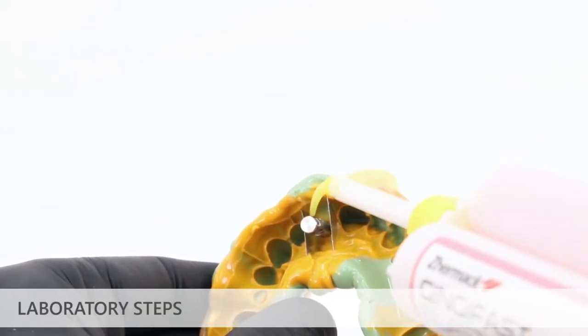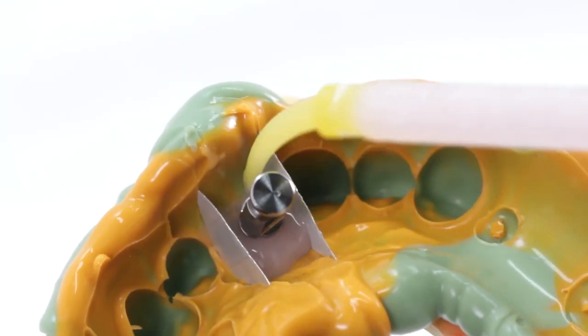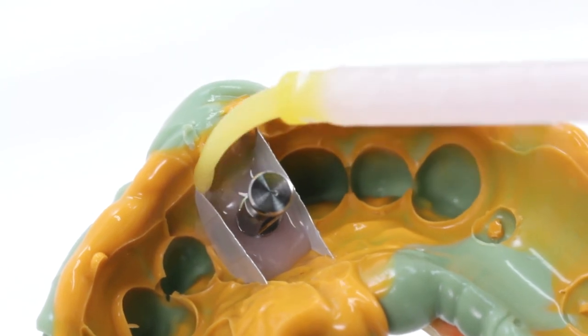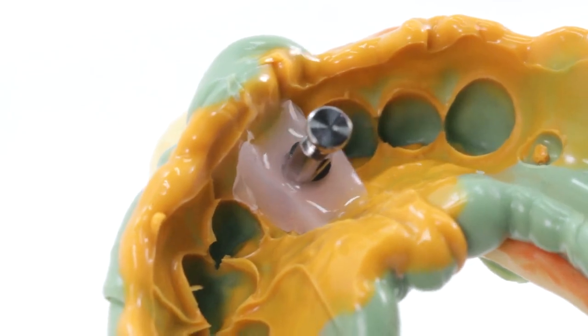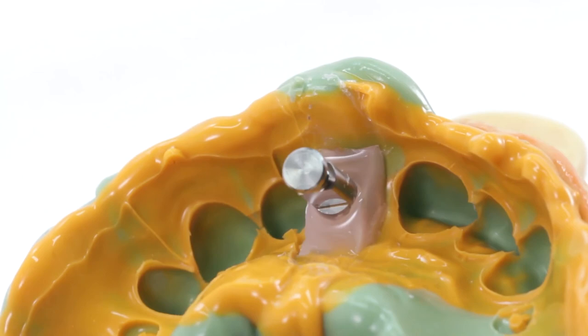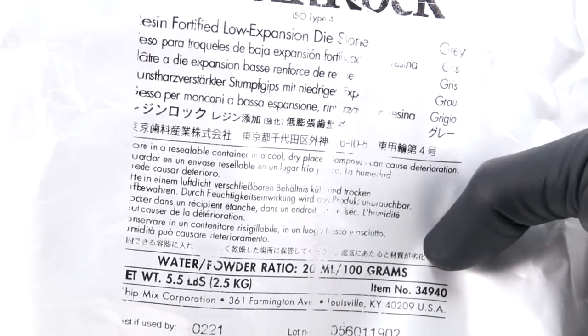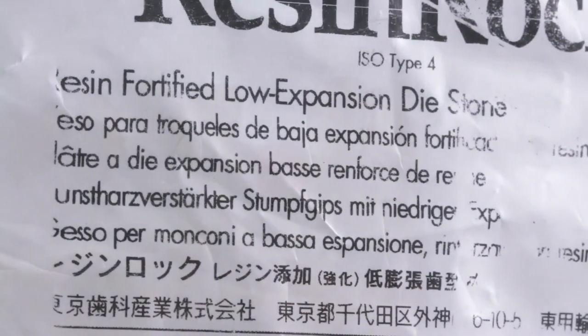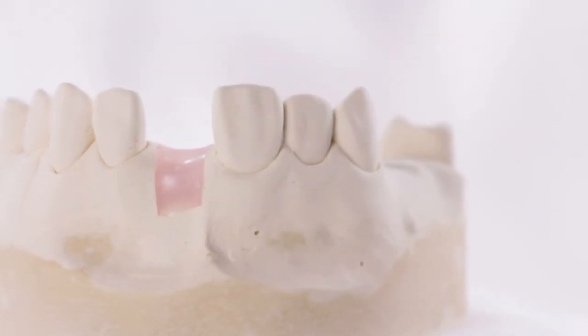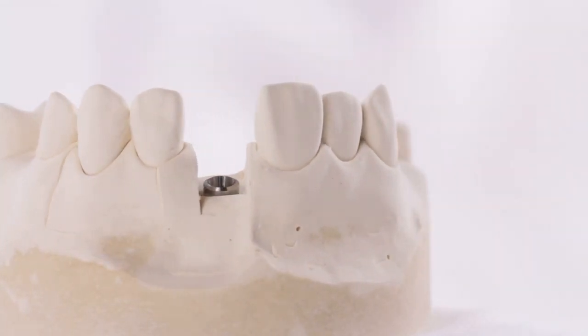The following steps are typically carried out in the dental laboratory and are not necessarily performed by the restorative clinician. Syringe soft tissue replica material around the impression coping and implant analog, ensuring that at least one to two millimeters of the implant analog neck is covered, then trim as needed. Pour the impression using ISO type 4 dental stone with low expansion and high hardness properties. Trim the dental model, articulate, and proceed with fabrication of the implant prosthesis using normal laboratory protocols.